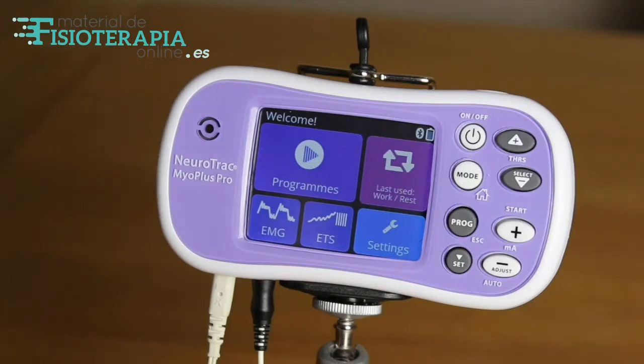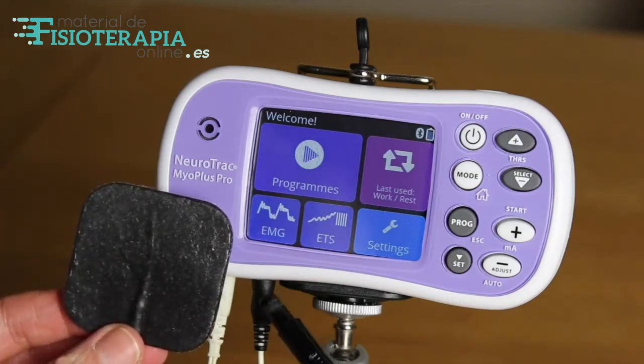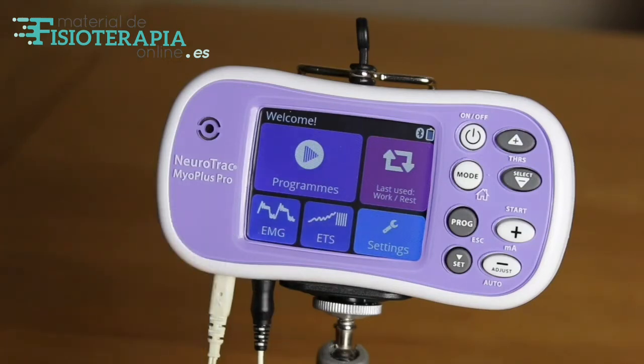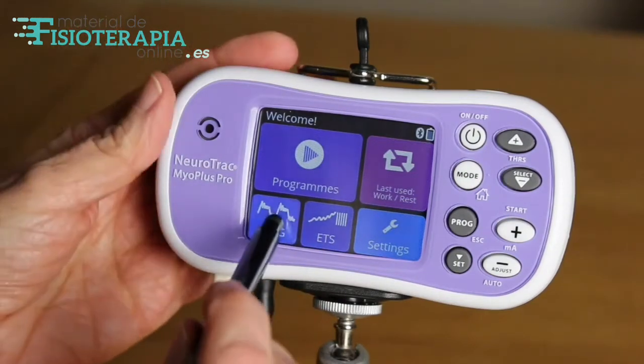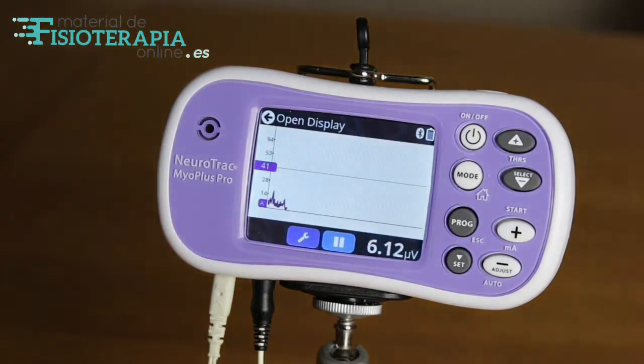Insert the Periform lead into the unit as before, ensuring full connection between the cables. EMG always requires use of a reference electrode to obtain an accurate reading. This can be placed anywhere on the body. It's good to spend a few moments to analyse the trace and to set the threshold level by viewing the open display.